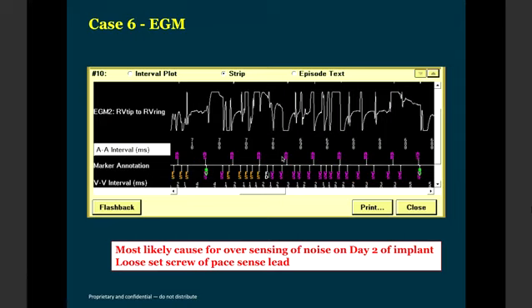Mukund, you want to add something to that? I agree with sir. Sensing is to the myocardium when you use true bipolar, because the proximal ring is closer to the myocardium, whereas in integrated bipolar it may be a bit proximally floating in the blood. The advantage is that you get an additional vector. That's all, sir.